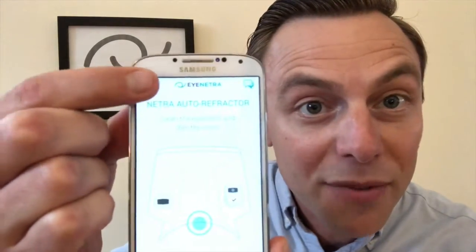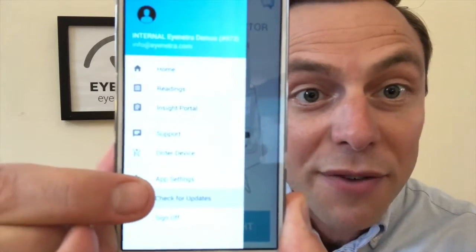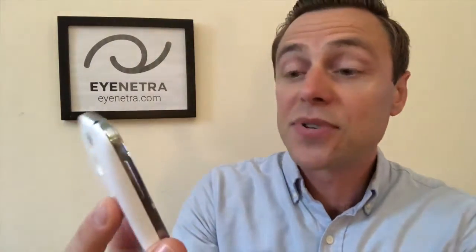At iNetra, we periodically make updates to the applications to not only improve performance but also to occasionally add new features. To make sure that you're running the latest version of the software, please first connect your iNetra phone to Wi-Fi, then open up either the Netra or the Netrometer apps, select the drop-down menu in the upper left-hand corner, and towards the bottom, select Check for Updates. If your app is up to date, you'll see a message letting you know. If an update is required, you'll see an option to take you to the Google Play Store. Simply click the link to quickly download the latest version.